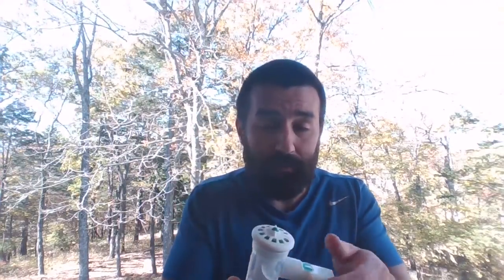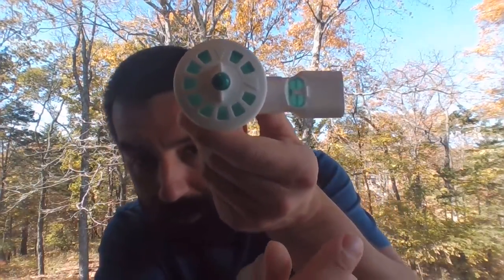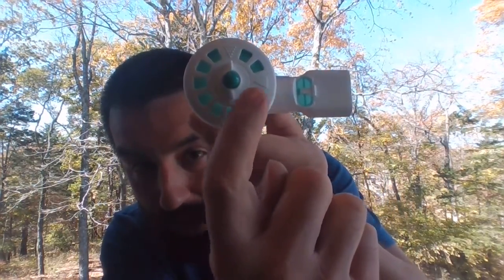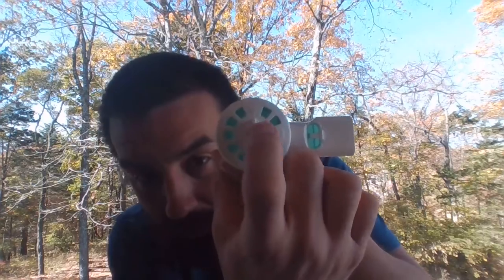Just a much more effective nebulizer. Now, let's say a patient can't seal their lips, or they're having difficulty. It does take a little bit more effort to draw that down. So if you see it's not really dropping down, or they're having trouble and they're short of breath, you see how that thing's kind of fluctuating. If you look really closely here, I don't know if you'll be able to see it, there's two options. This little piece here turns, and whatever line it's pointing to is kind of what's going on.